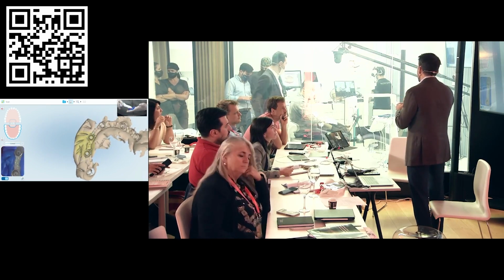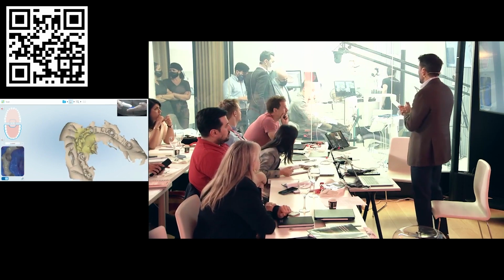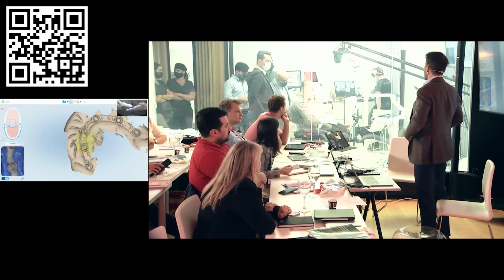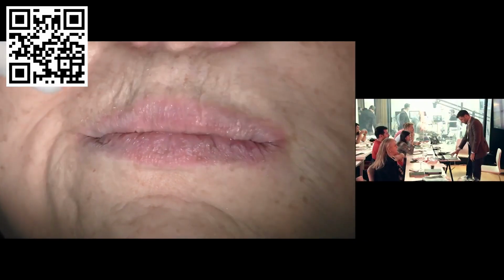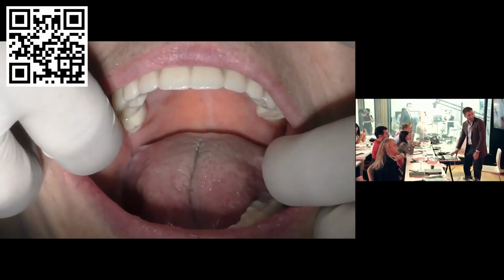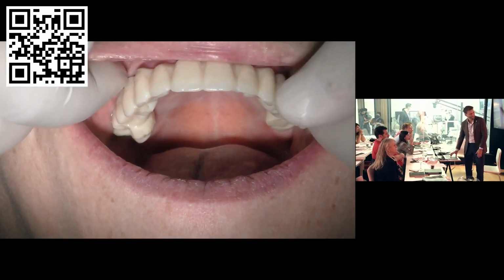Can you show the bridge that has the hole inside? The other option, can Angelo, can you show now? Look to the patient. Abre, Georgina. Look there. What do you want me to see? And take it out, quítala.